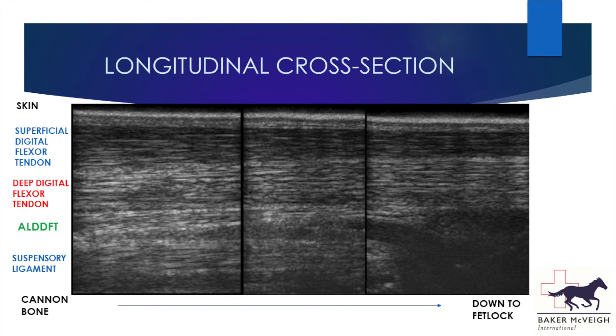Looking at the longitudinal cross section, this is obtained by rotating the probe 90 degrees so that it's angled along the length of the tendon, giving us a nice image of the fibre pattern. We should see the fibres of the tendons running parallel to the skin, except for the fibres of the check ligament, which are slightly angled as it takes a diagonal path up towards the deep flexor tendon. At the lower end of the image the suspensory ligament disappears as it splits and is no longer visible on the midline view.